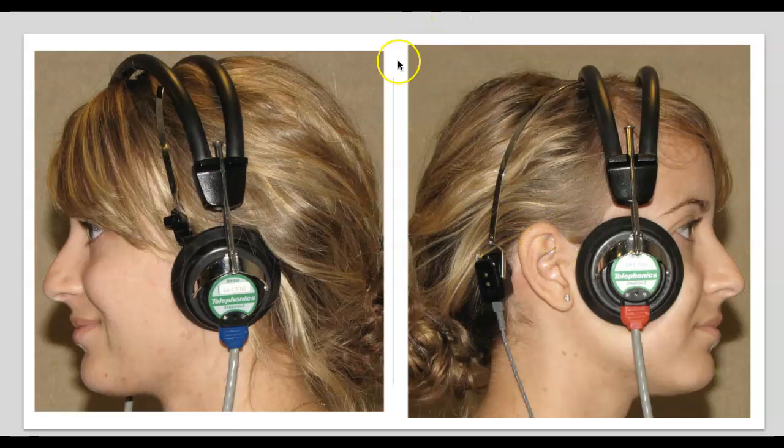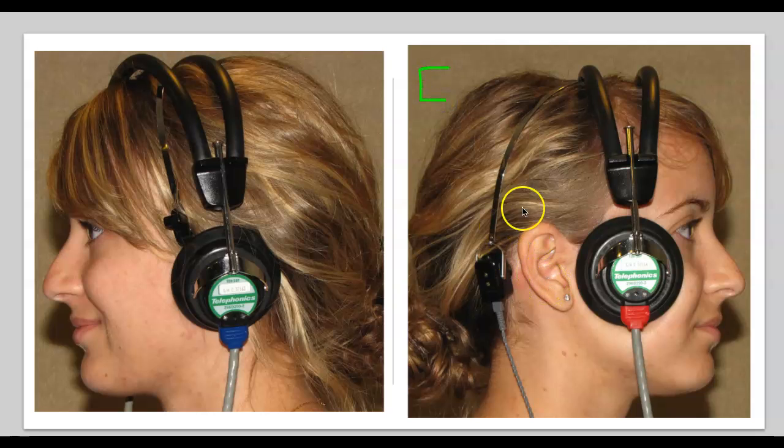And if you remember, the right masked bone conduction score looks like that, right? Because it's facing the right side, so that's the right masked bone.